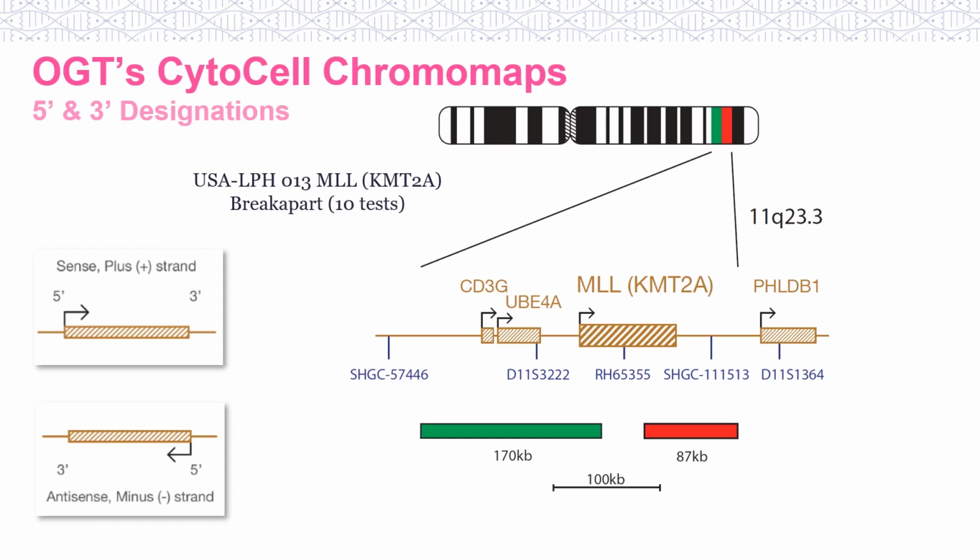Now let's use the FDA-cleared USA LPH 013 MLL, also known as KMT2A break-apart probe, to walk through an example of how to determine which fluorophore provides the 5' or 3' coverage.